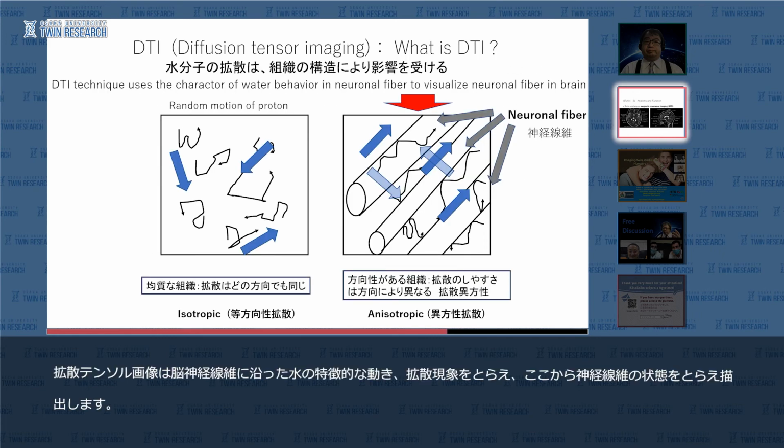Diffusion tensor imaging (DTI) is a promising method for characterizing microstructural changes or differences with neuropathology and treatment. The diffusion tensor may be used to characterize the magnitude, the degree of anisotropy, and the orientation of directional diffusion. So basically, DTI can describe the detailed condition of brain neuronal fibers.